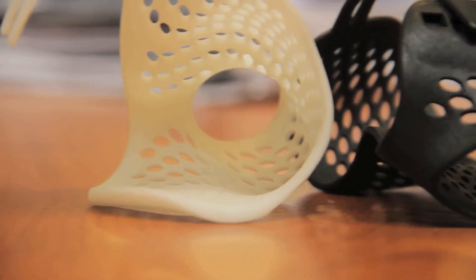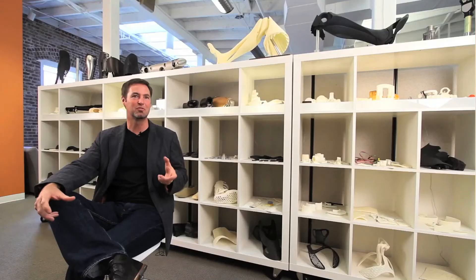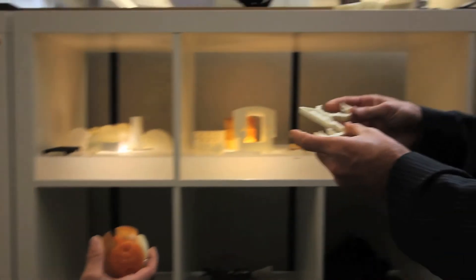Every day the FedEx truck arrives and we open up the box like a bunch of kids on Christmas day, and we hold these parts that had been digital only on our screens two days earlier.